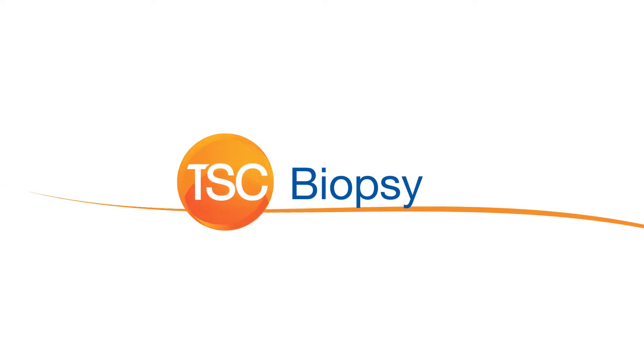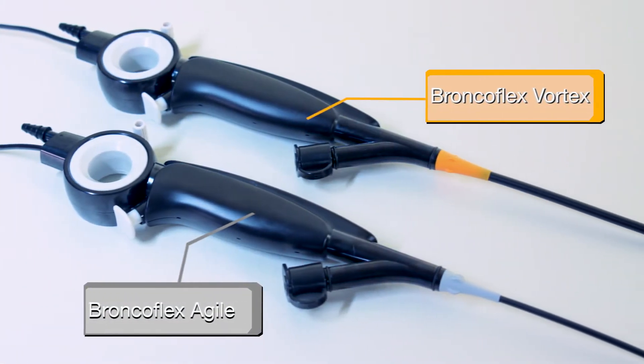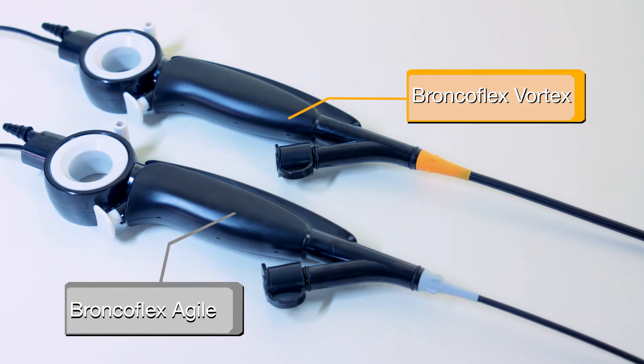The BroncoFlex can be used with biopsy forceps for taking tissue samples for diagnostic purposes. The BroncoFlex is available in two sizes that are color-coded: gray for BroncoFlex Agile and orange for BroncoFlex Vortex.